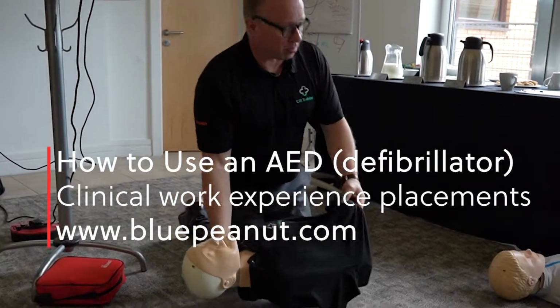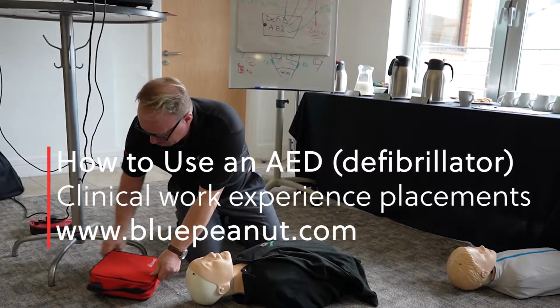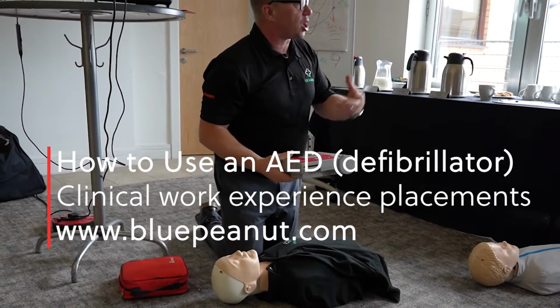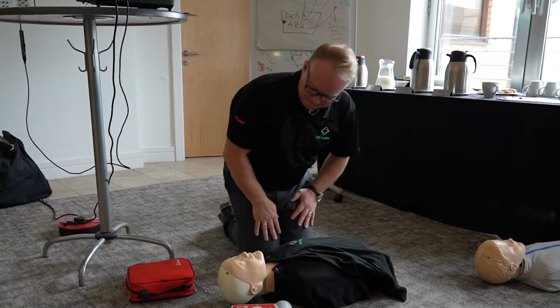So: unconscious, blue, not breathing. Yeah? Take your defib out. Turn it on. Some you have to turn on, some they'll turn on themselves. Listen to what it has to say.